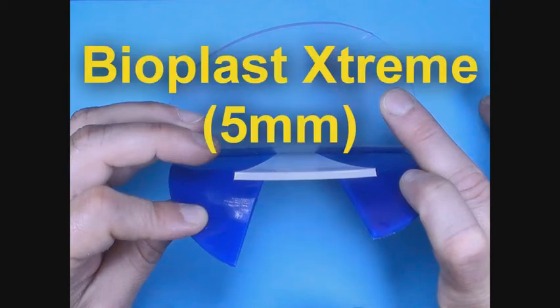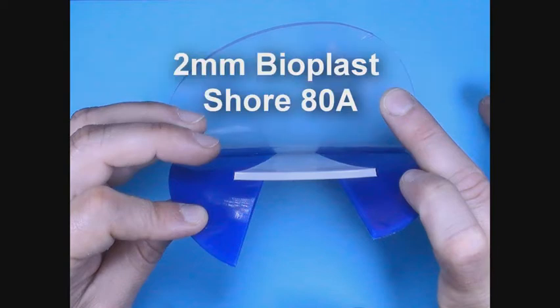The 5mm Bioplast Xtreme consists of the same material as the Pro, with the difference being a thicker, clear 2mm BioPlast cover plate.